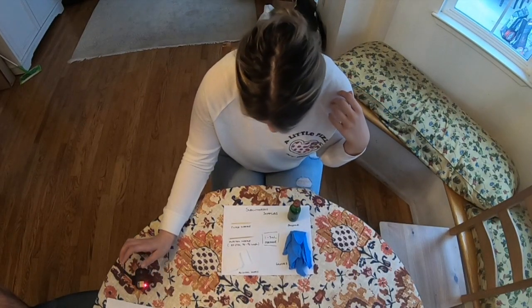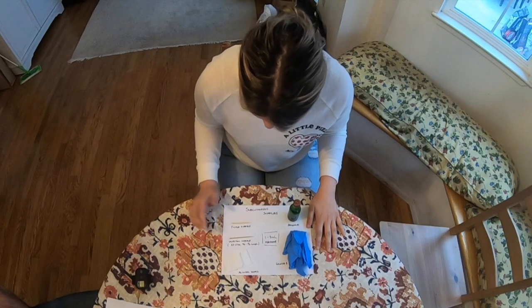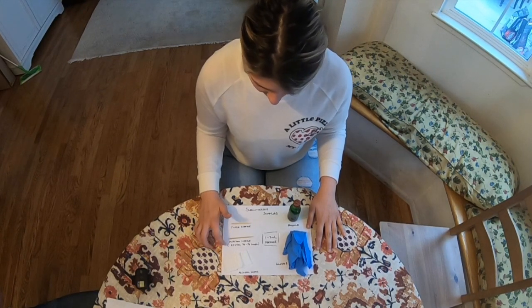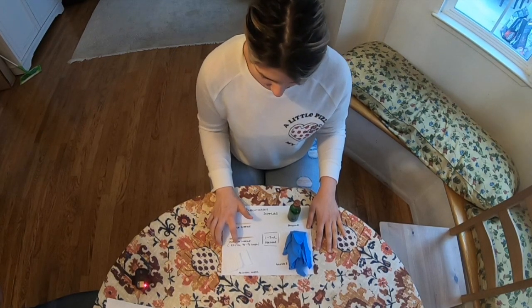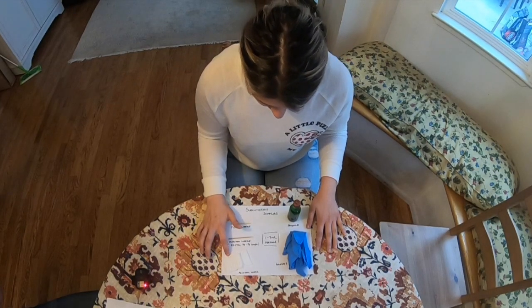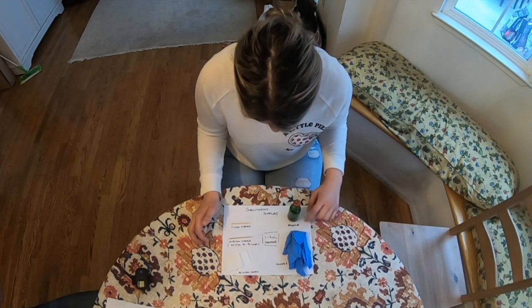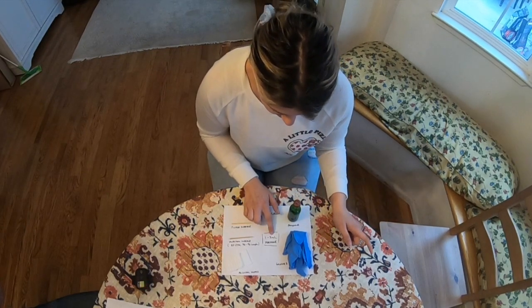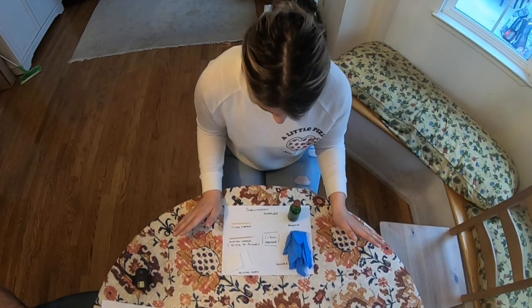Subcutaneous injection supplies: a filtered needle, an injection needle either 25 to 27 gauge, three-eighths or five-eighths in length, alcohol wipes, gloves, in this case an ampoule for medication, and a one to three ml syringe.